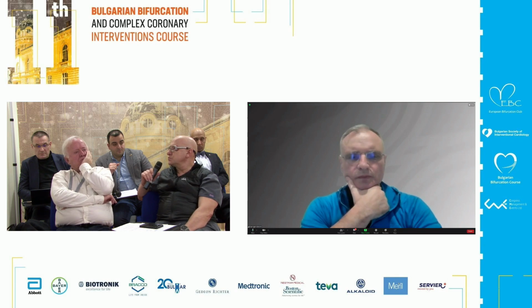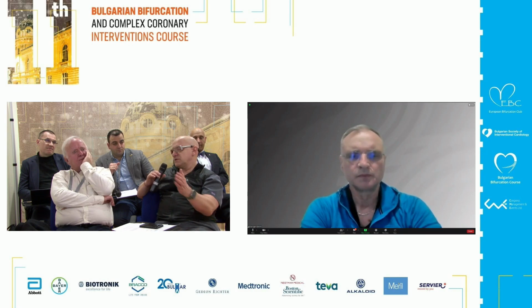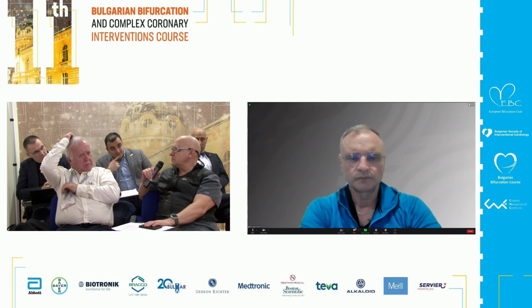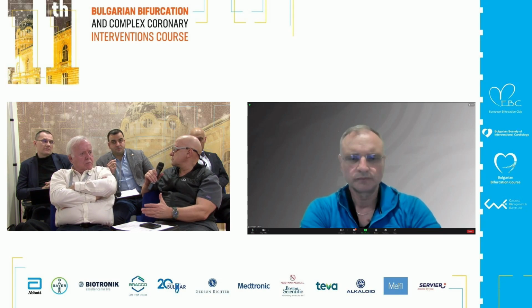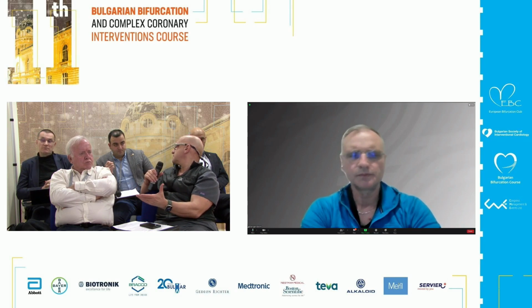Cases with JCTO score 2 are on the edge, but for those which are higher, you should consider the retrograde approach. So if you start with simple cases, 0 and 1, the success rate is around 70 percent and even more. And George is right, if you put a patient on the table, and this is the concept we have in the EuroCTO Club, your expected success rate should be around 70 or higher, because otherwise it is not justified, and it is not fair to the patients.